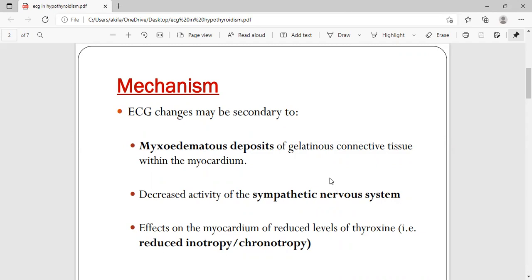Two changes commonly seen in hypothyroidism are low voltage ECG and bradycardia due to decreased sympathetic nervous system activity. Also, reduced levels of thyroxine have an indirect effect on the myocardium, leading to reduced inotropy — that is, reduced contraction of the heart — and reduced chronotropy, meaning decreased heart rate.